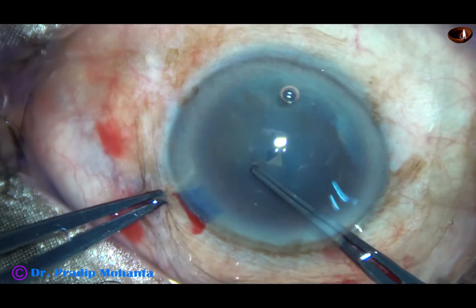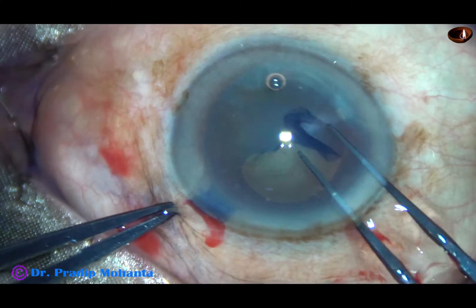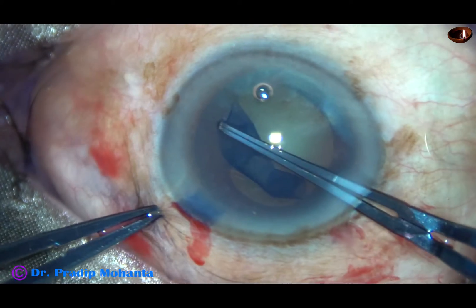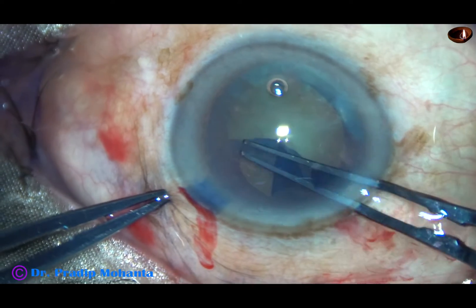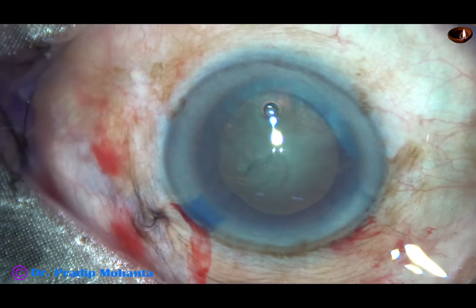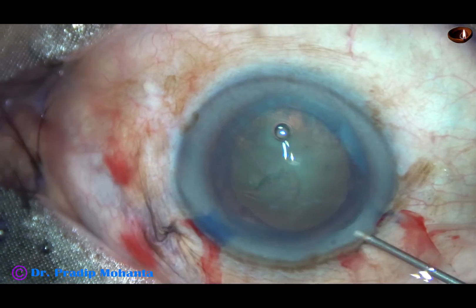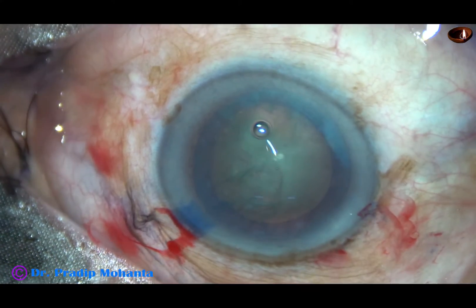With the help of the utrata forceps, the anterior capsule is torn and a capsular tag is held. An adequate size capsulorhexis of about 5.5 mm is done. This is a very good rhexis. We will see at the end of the surgery that the anterior capsular rim will overlap the optic of the intraocular lens all around.